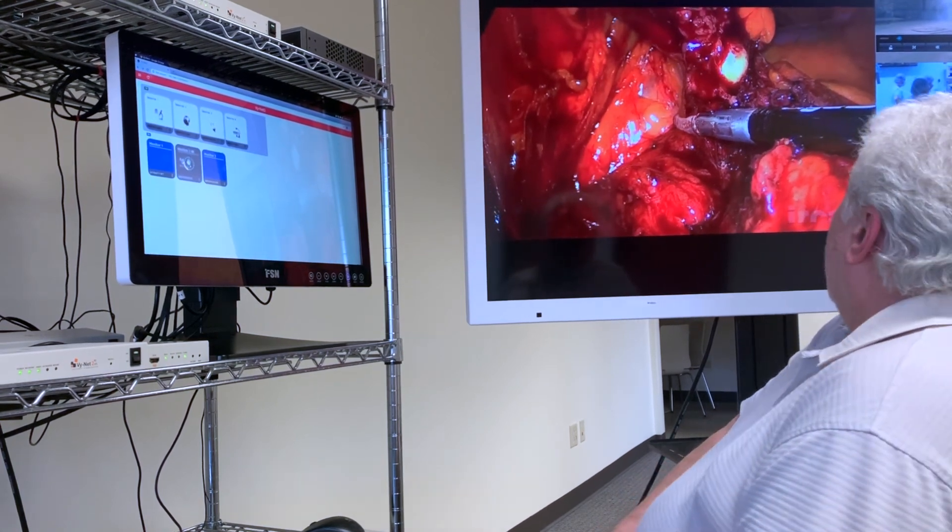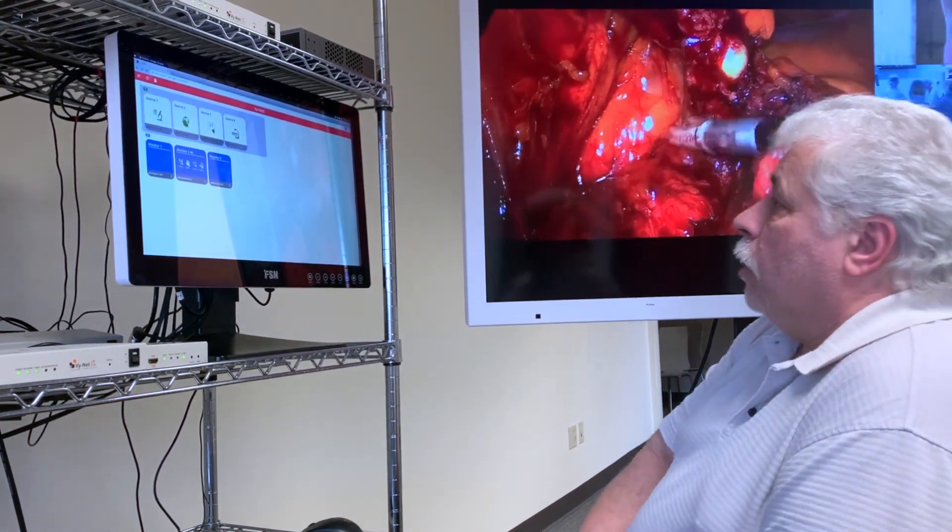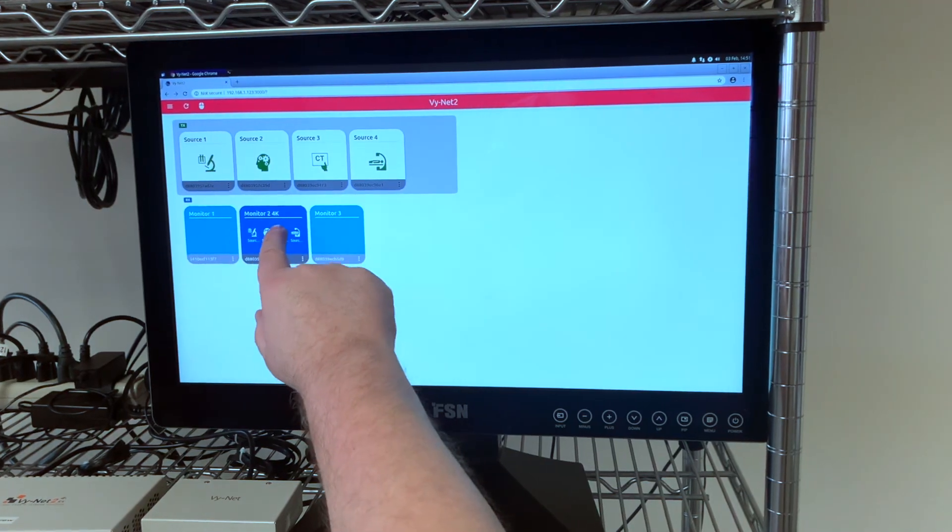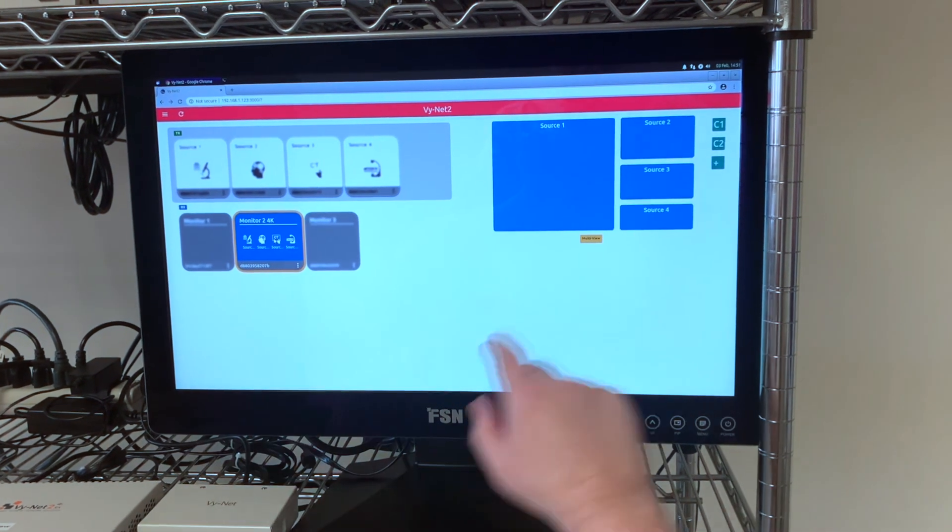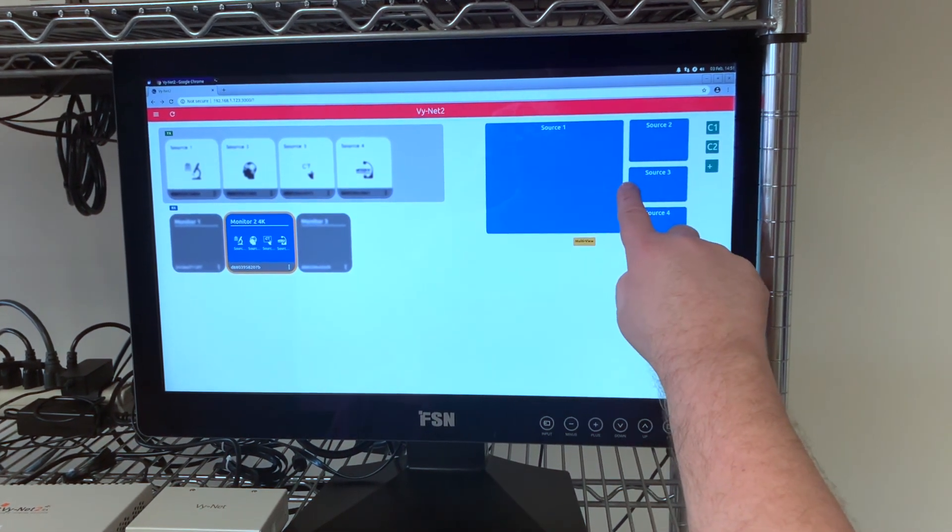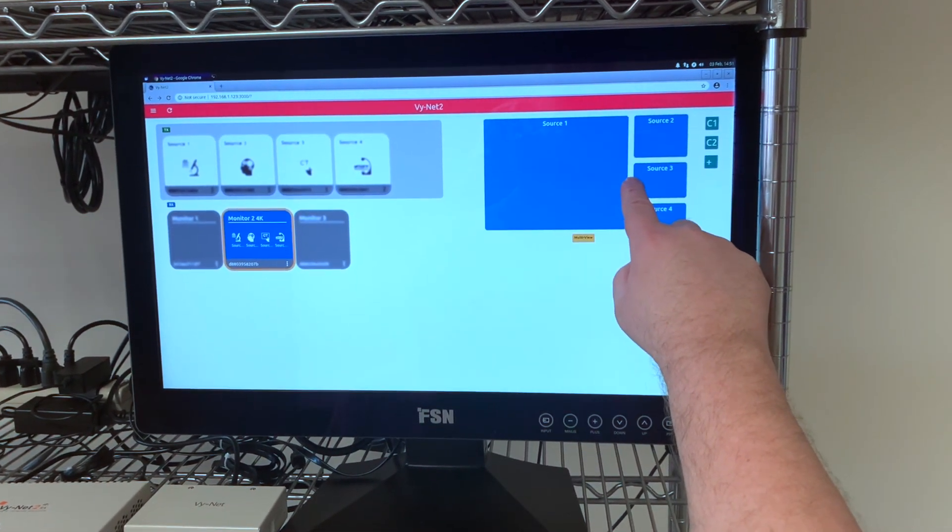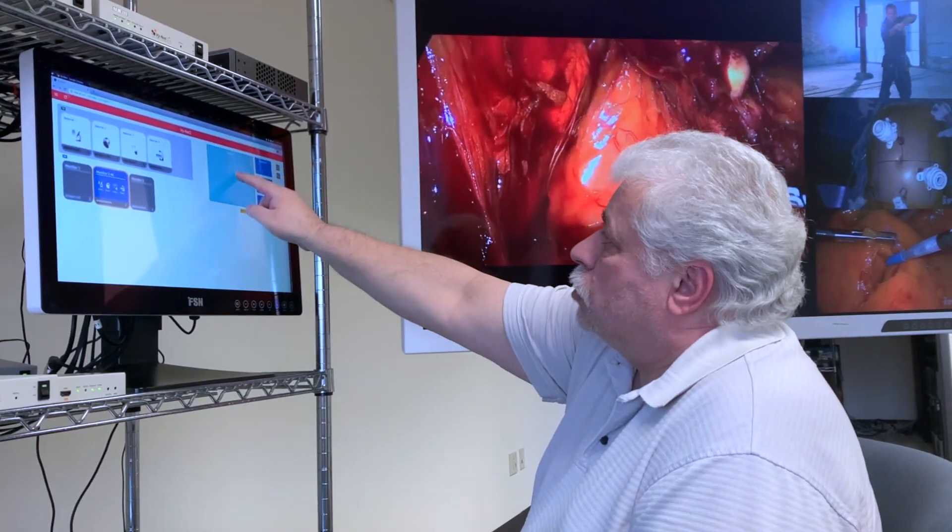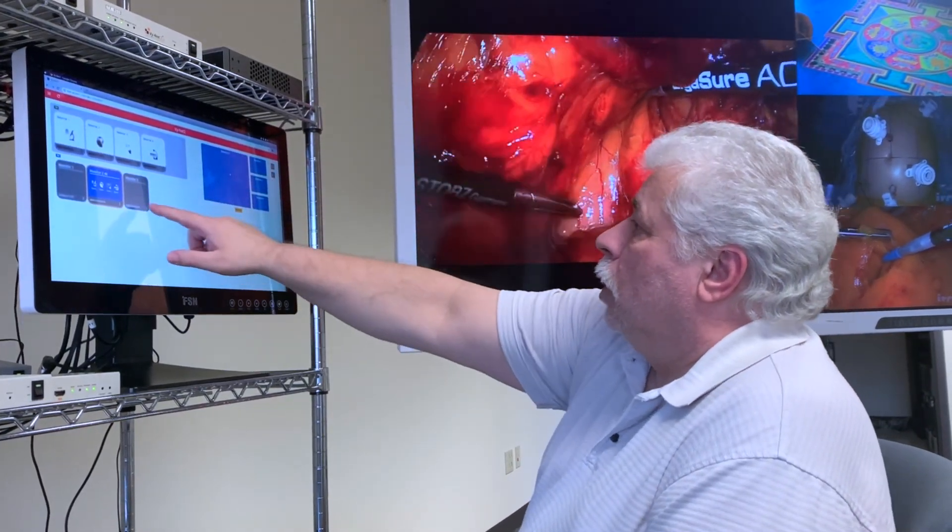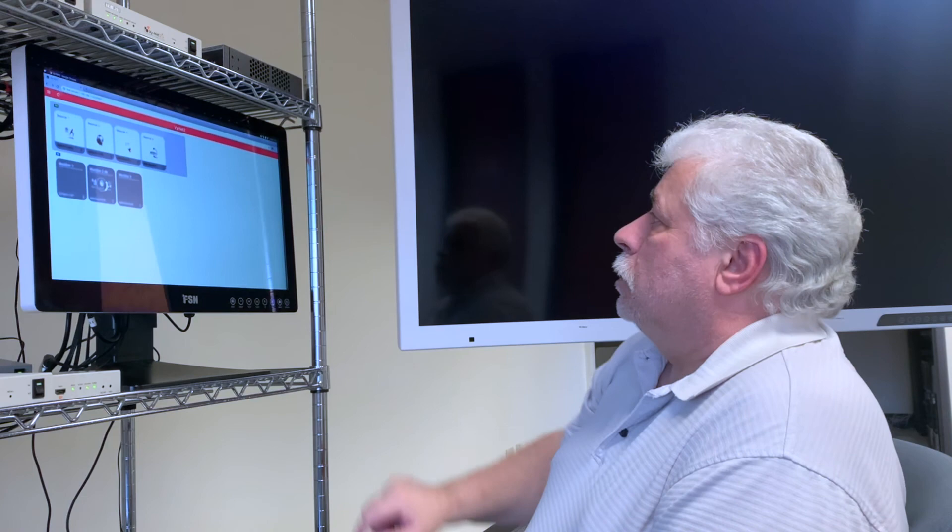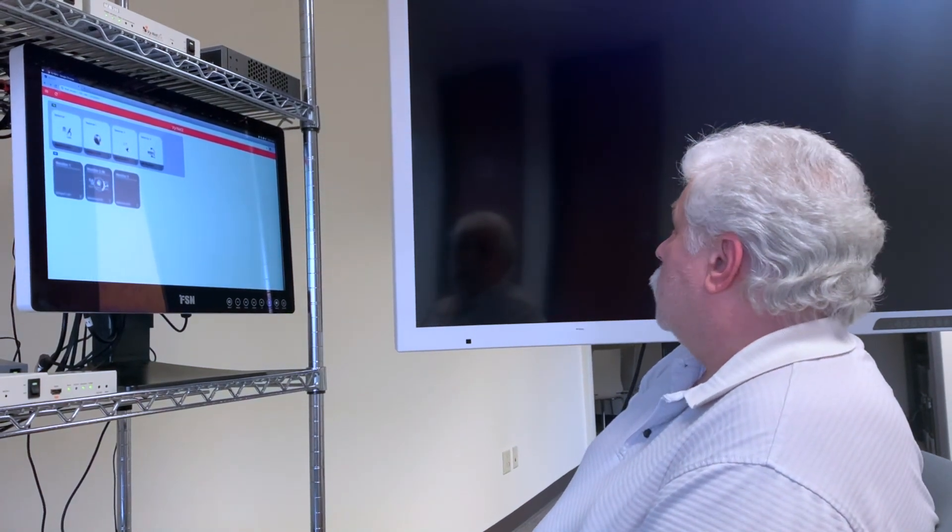And once you have your layout set the way you want it, you can also go back by touching the monitor and readjusting. Or you can also swap sources and then route it back out to the main monitor.